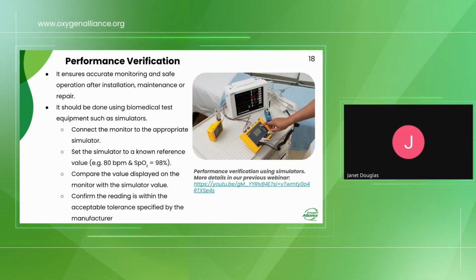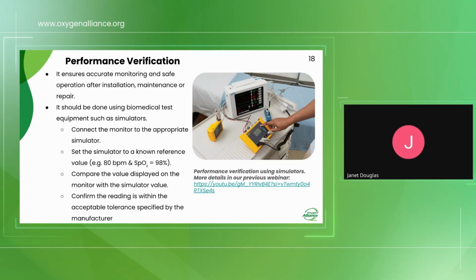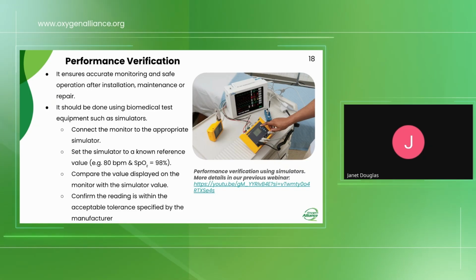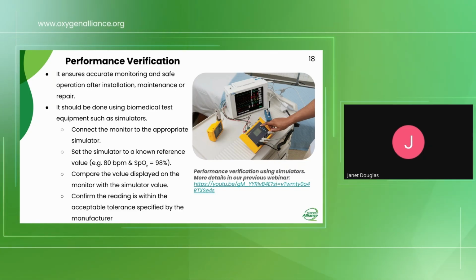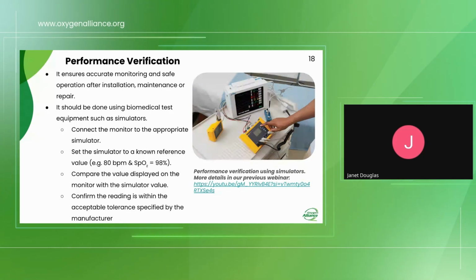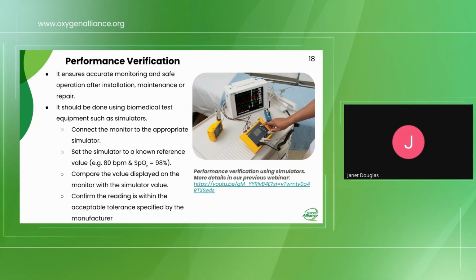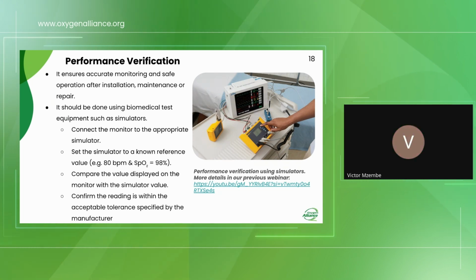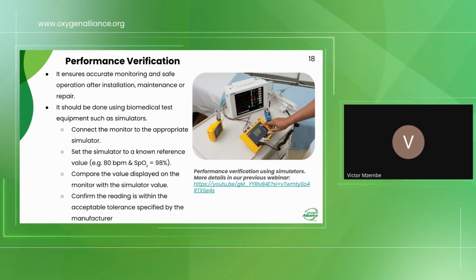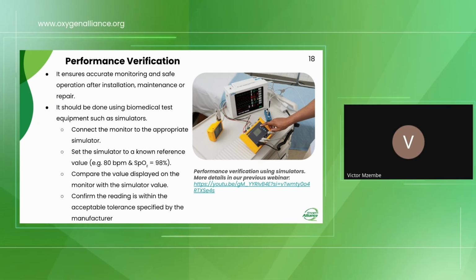But otherwise, every analyzer has specific processes that you follow when measuring either the leakage current or the voltages themselves, because there are so many tests that you have to do based on the ISO standards. All right, thank you so much, Janet, for that explanation.